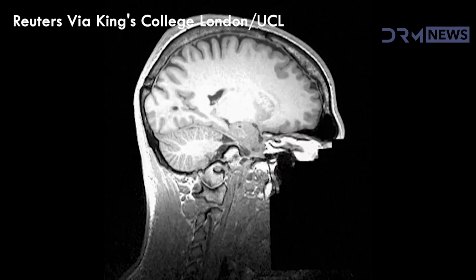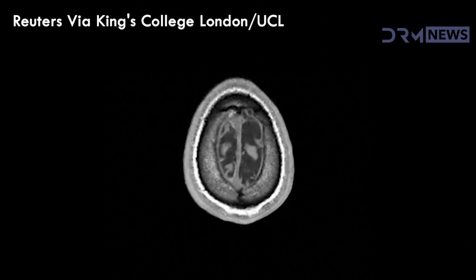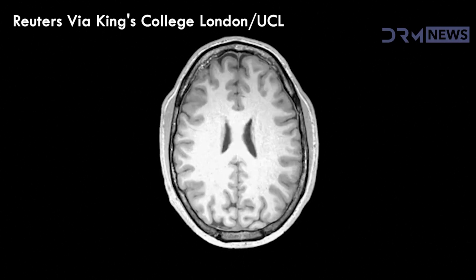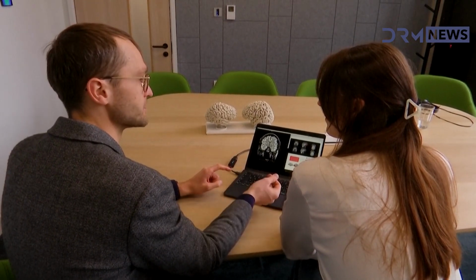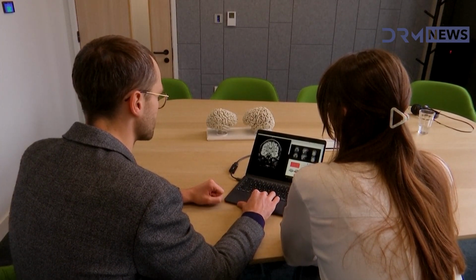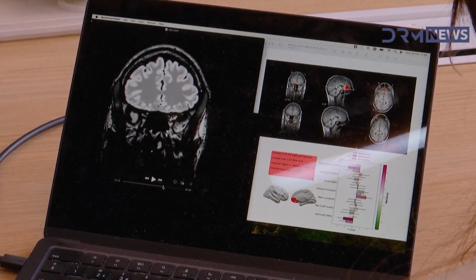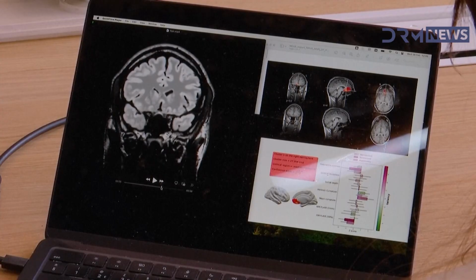Scientists in London have developed an AI tool, MELD graph, to detect previously invisible brain abnormalities that cause epilepsy. The system, trained on MRI data from over 700 patients, identifies around two-thirds of subtle lesions missed by radiologists. By highlighting abnormalities and explaining its findings, MELD graph speeds up diagnosis and improves access to surgery, offering potential cures for epilepsy patients. The open-source tool is now being introduced to global clinicians and researchers.